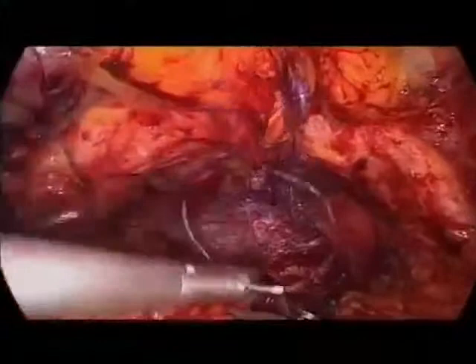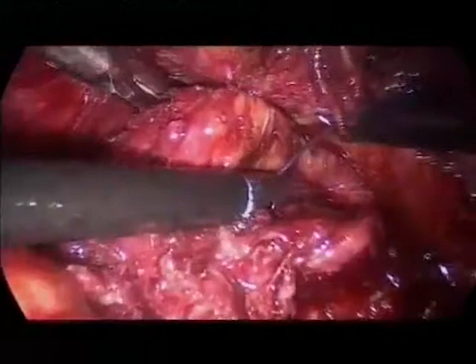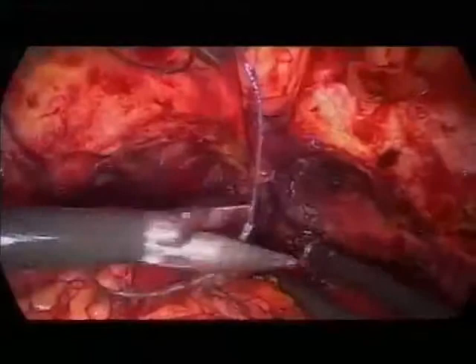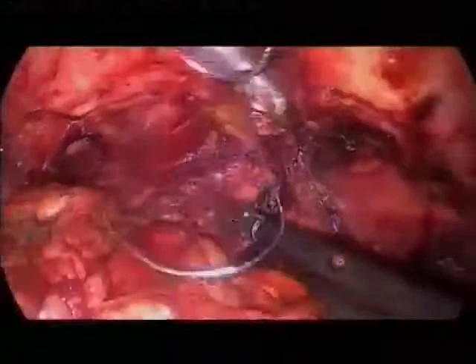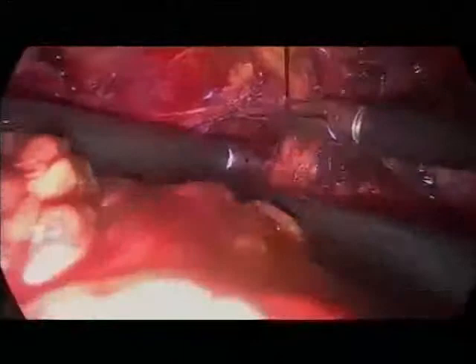You have very nice access on apical dissection. And do you think it's very useful to place this stitch now? Do you have experience of direct division of the venous plexus without any suture, and suturing after section? I tried it 5 times, and three out of 5 times we had a lot of blood in our sucker. For this reason, we went back. So actually, I don't have really experience with cutting without suturing. We always suture the Santorini.